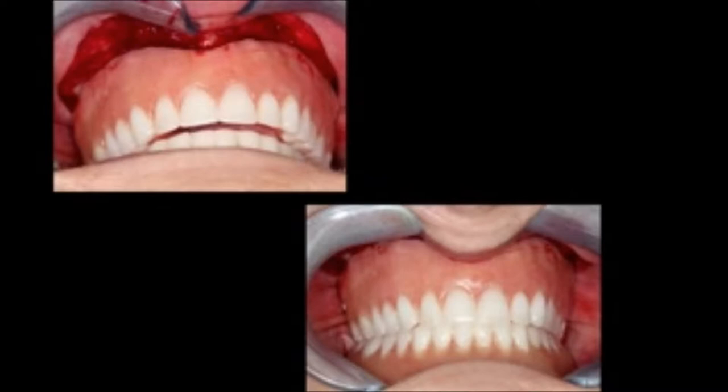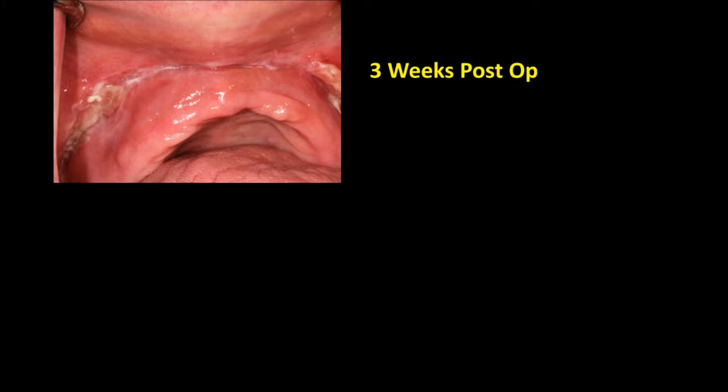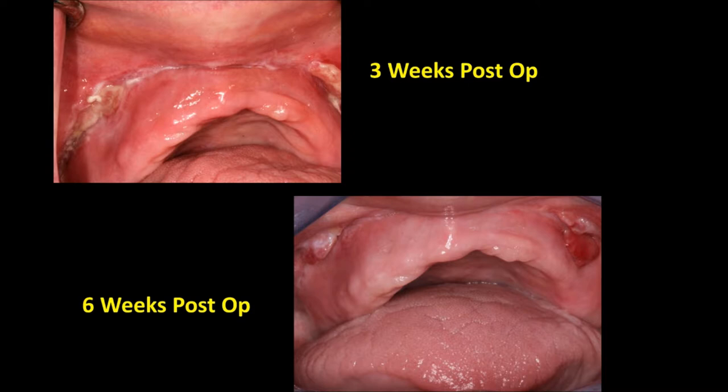She can actually do some functioning with this denture. The vestibular depth has been increased from 7mm to 12mm. Here we see a 3-week post-op, and you can see some excessive redundant tissue at the depth of the vestibule. We let it heal for another 3 weeks, and this tissue has not completely resorbed. So we're going to use a radiosurgery unit to remove that excessive tissue.